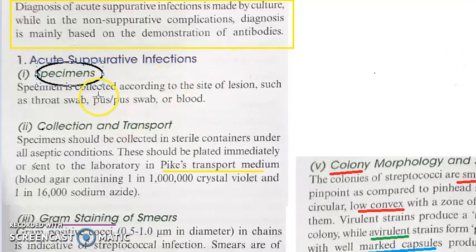Specimen collection, you will collect the pus, right? Pus or blood or throat swab. So you will collect the throat swab, the pus; suppurative is what? Pus or the blood, okay? You can collect from the site of lesion.